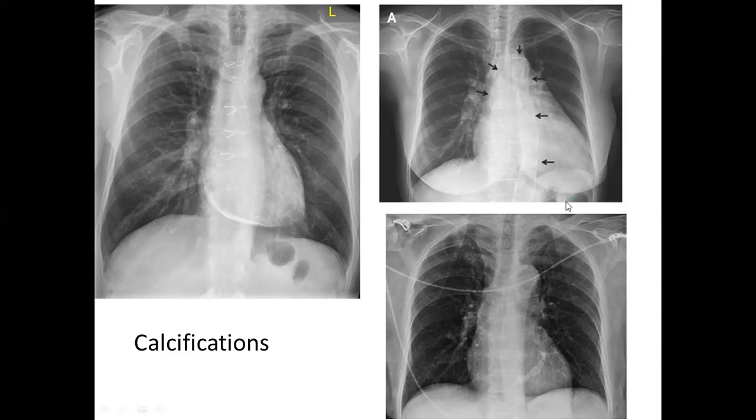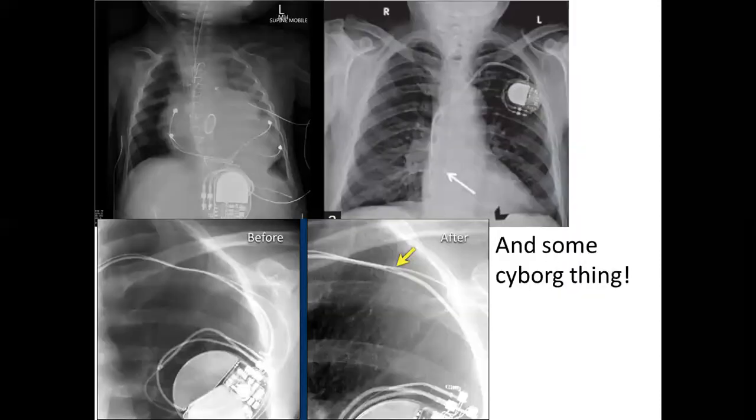Patients have calcinosis of the aorta. For example, if a patient has atherosclerosis or chronic inflammation like aortitis, and this patient has calcification of the fibrotic ring of the mitral valve. So sometimes you may notice these types of changes, these X-ray positive structures on the heart shadow, due to some checkups. And maybe you can find some very obvious mechanisms which can elongate the patient's life.